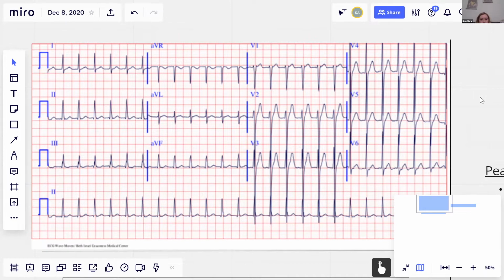We look at an ECG. As was mentioned, I'm looking at, is this from the sinus? Is it a regular or irregular rhythm? And then is it narrow or wide, are some of the points. Anytime I hear a heart rate of 150, I have to think atrial flutter in a 2-to-1 pattern.